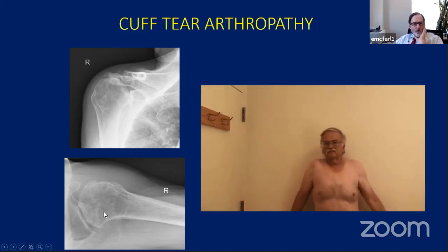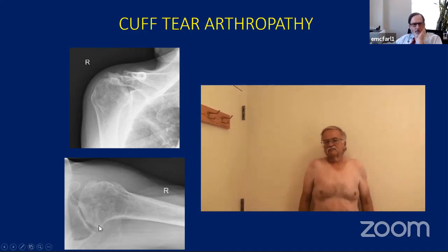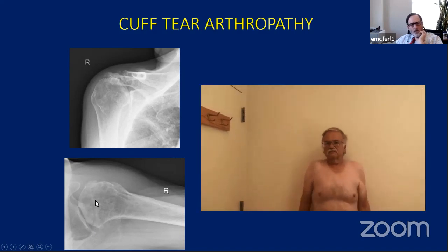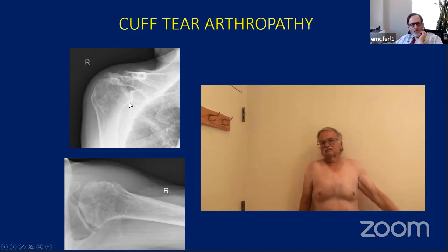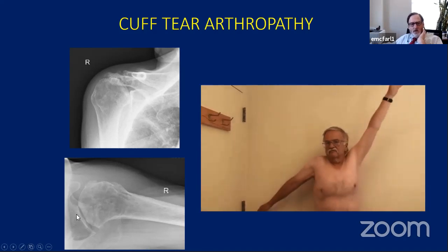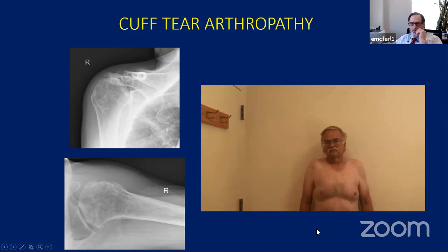This is his axillary, which shows he does indeed have some areas of avascular necrosis, and the sphere is not a sphere any longer. Also, the glenoid has become somewhat deformed. You have to worry a little bit about bone loss up superiorly. I personally get CT scans on everybody. This is a patient who has adequate glenoid bone, so you probably don't need a CT scan in this situation.